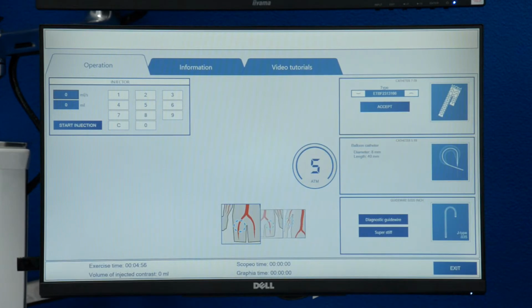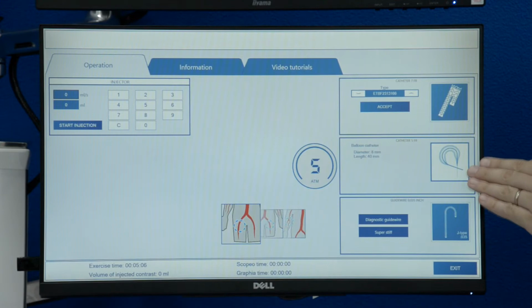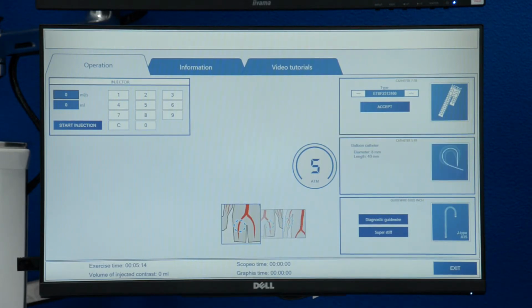When working with the instruments, the software will tell you by lighting up in white that the instrument is inserted. So let me show you. I am inserting the instrument until I see it light up in white. There it is. It means that it is picking up the instrument with the sensors. And when you are changing the instrument, you can remove it completely, or you can pull it out just enough until it stops lighting up in white.